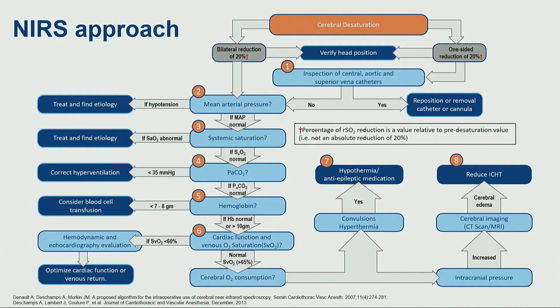I really want to spend some time on this because once people put NIRS on their patients, they think about the values, and there is a whole lot of confusion on what to do when the NIRS values change. This is a great reference if you have time. These papers came out about 10 years ago from a group in Europe, but I still use them for teaching myself and for teaching you all.